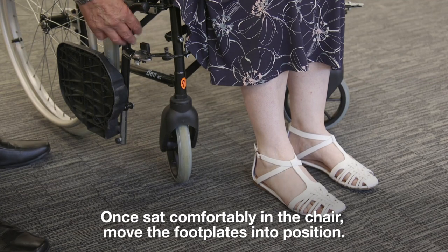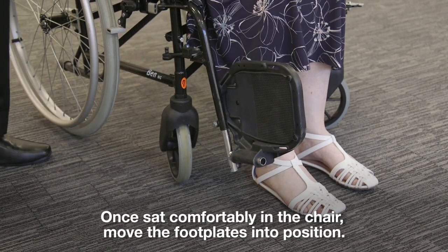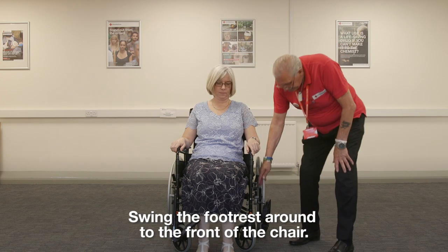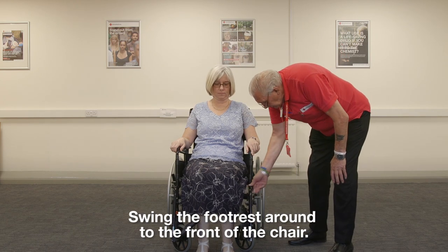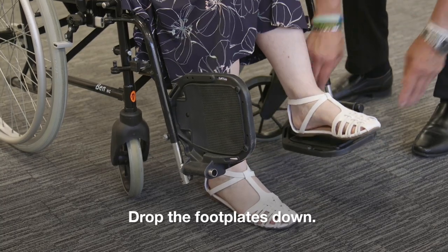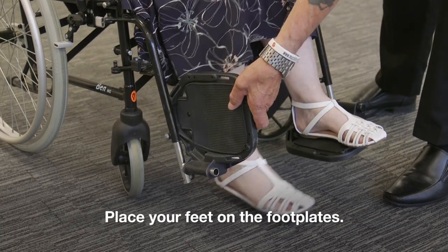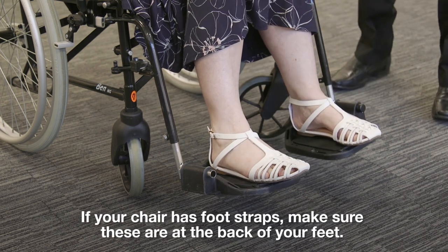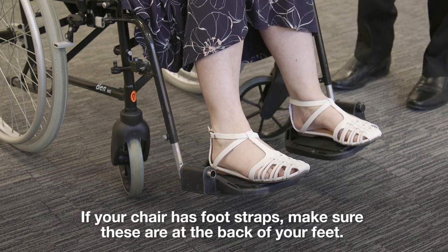Once sat comfortably in the chair, move the footplates into position. Release the footrest catch and swing the footrest around to the front of the chair. Do this on both sides of the chair. Drop the footplates down and place your feet on the footplates. If your chair has foot straps, make sure these are at the back of your feet.